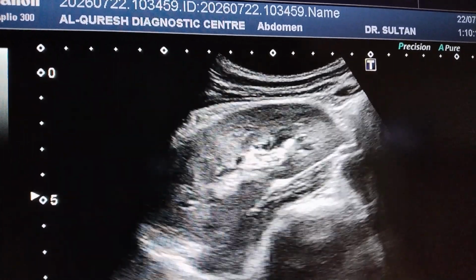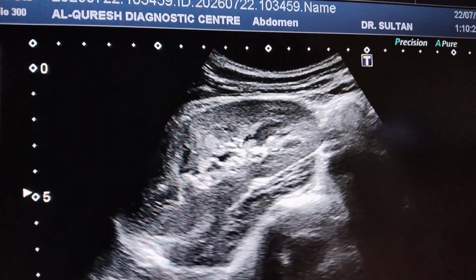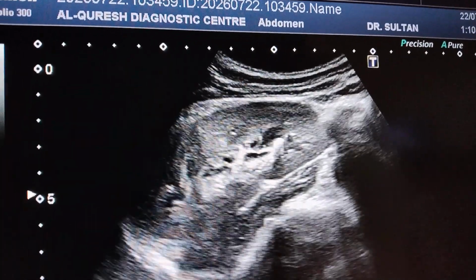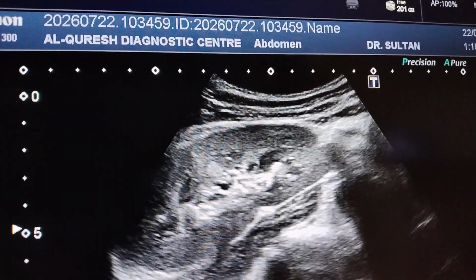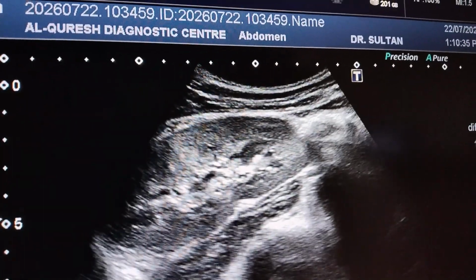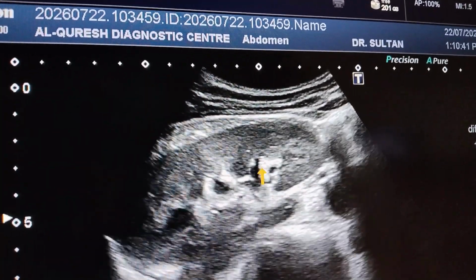First, whenever we find such an echogenic focus which we suspect is a tiny stone, or a renal sinus fat droplet, or a concretion. So here we are suspecting this tiny focus. What is this?